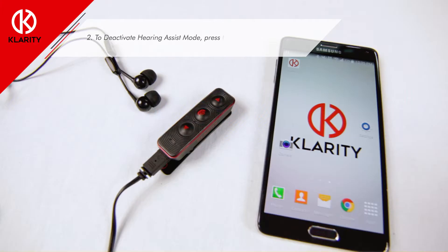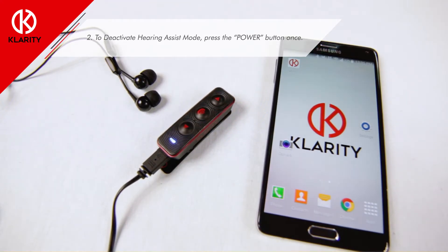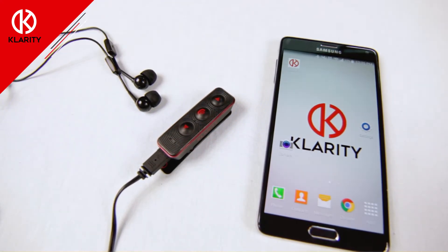Step two: to deactivate hearing assist mode, press the power button again. The indicator light will go back to blue, showing that the unit is no longer in hearing assist mode.